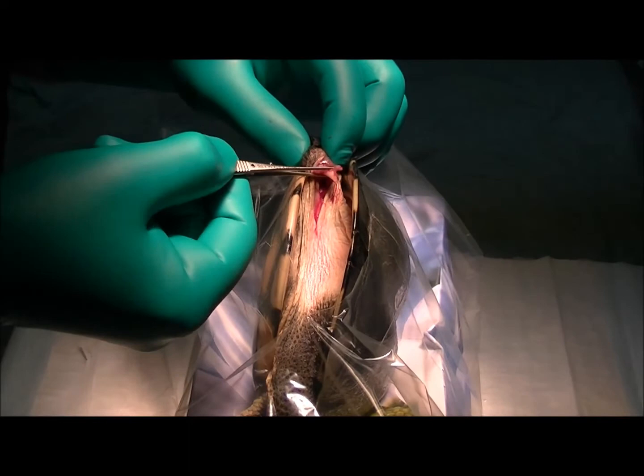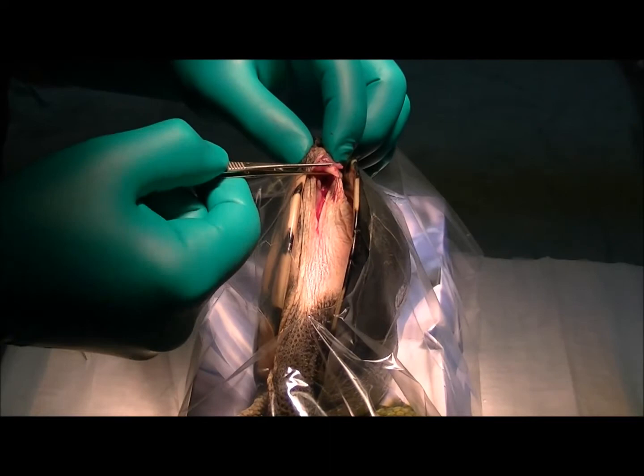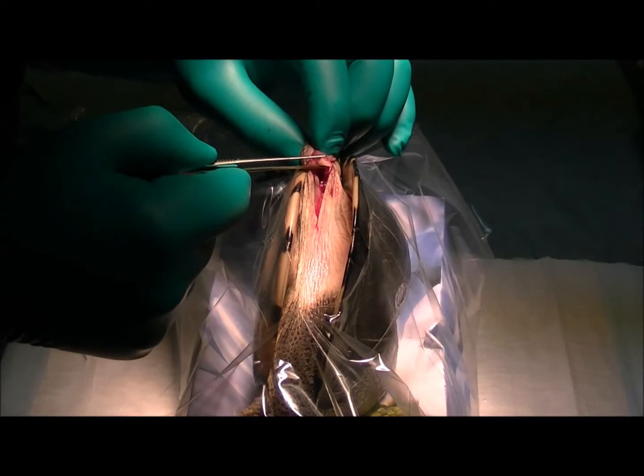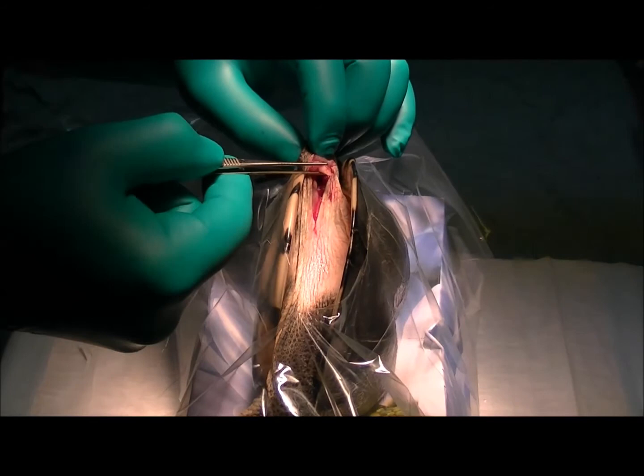We've made our incision and I've found the first part of the fragment — I'm holding that with my forceps there. That's what we call the distal fragment, or the fragment down towards the elbow, and it's got a nice smooth break right through it. I'm just going to dig around a little bit deeper and see if we can find the proximal part, or the upper part, so we can line that up and try to put a pin down the middle to get it back in a straight line.